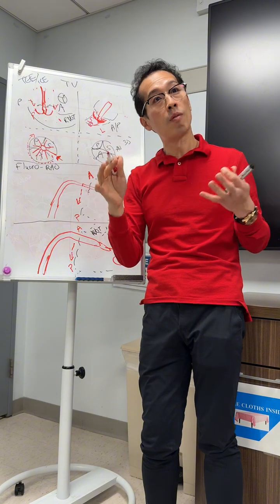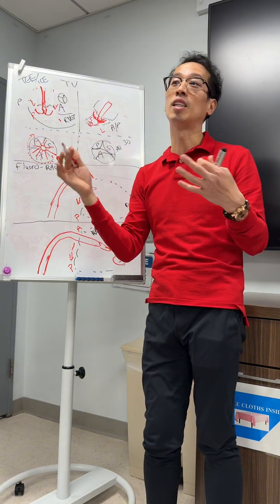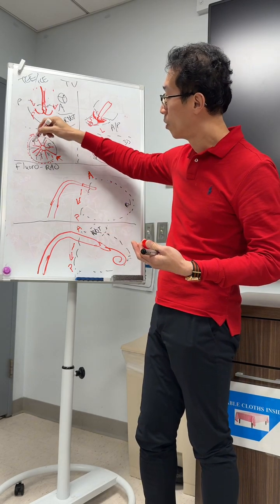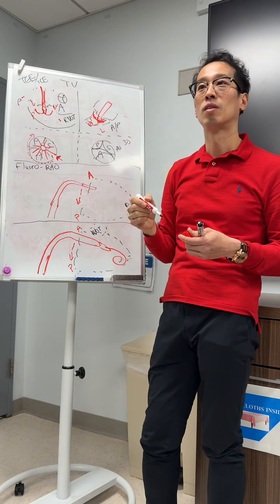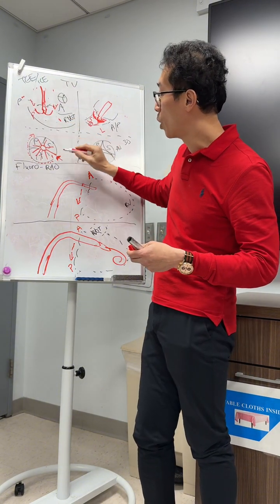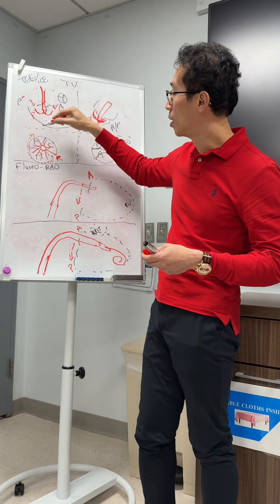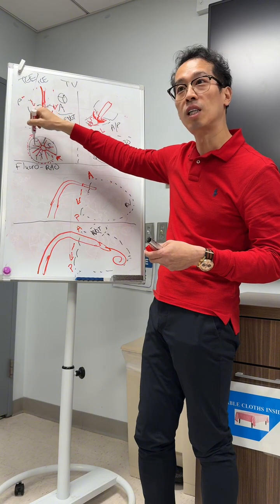Okay? Now, here's the trick. A lot of times, they have RV leads, CIED leads, or some other device. You get shadowing, you can't see. So when you are spinning, pay attention not just to this side, but to this side. Why is that? Well, if you think about it, this is across that beam. I'm spinning, I'm here now, I can't see here.